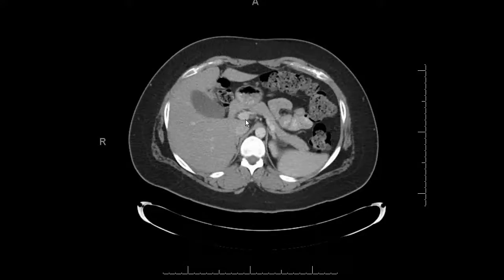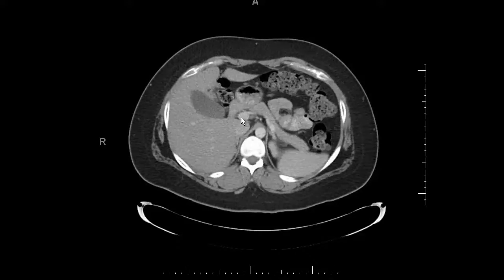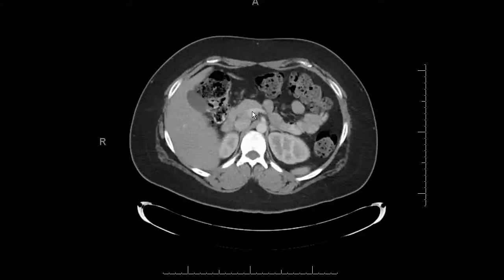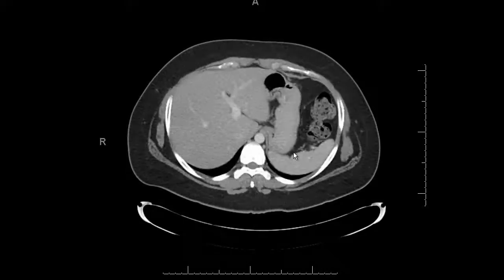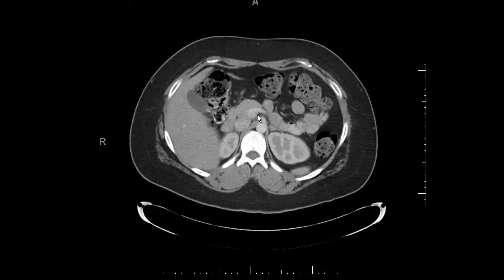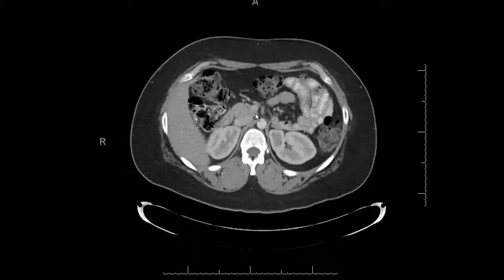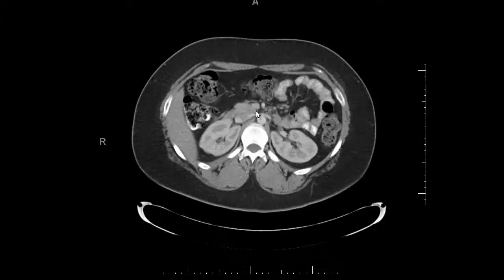Then I look at the vessels of all the organs I've just reviewed. We already looked at the main portal vein; here's the splenic vein — make sure that's patent, as many conditions can cause splenic or portal vein thrombosis. Then the SMV: once you find the portal and splenic confluence, keep scrolling down a little and you'll lead right into the SMV.